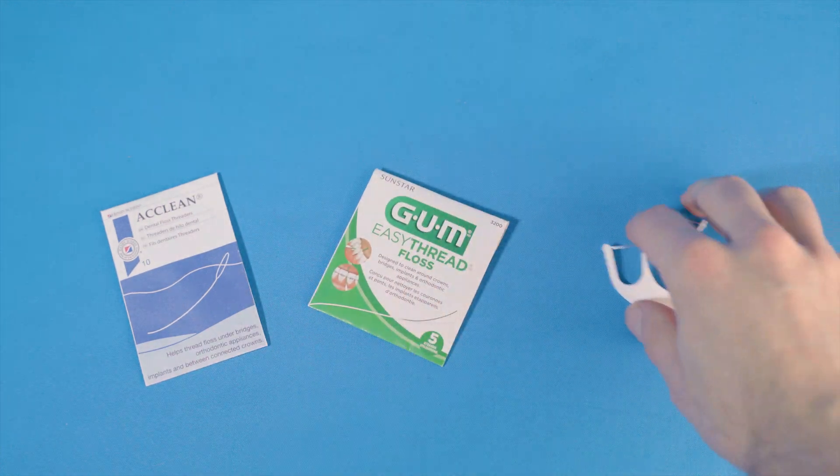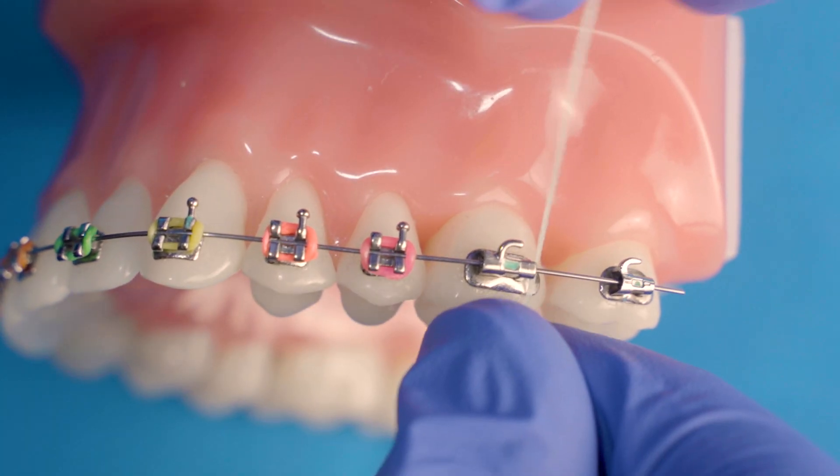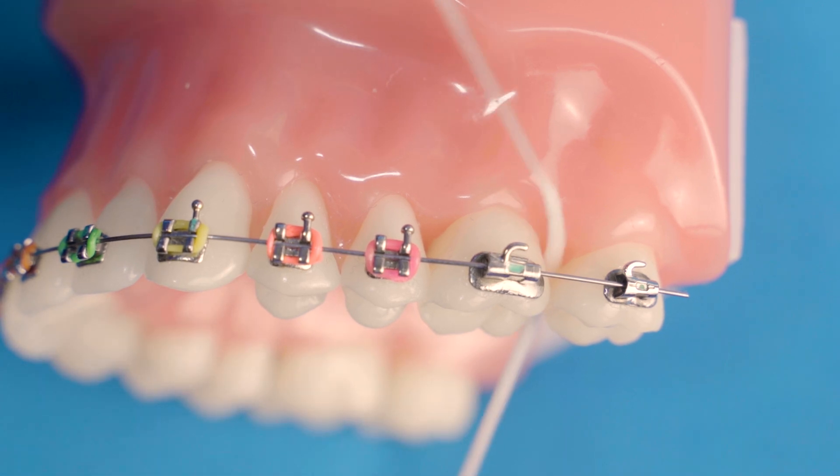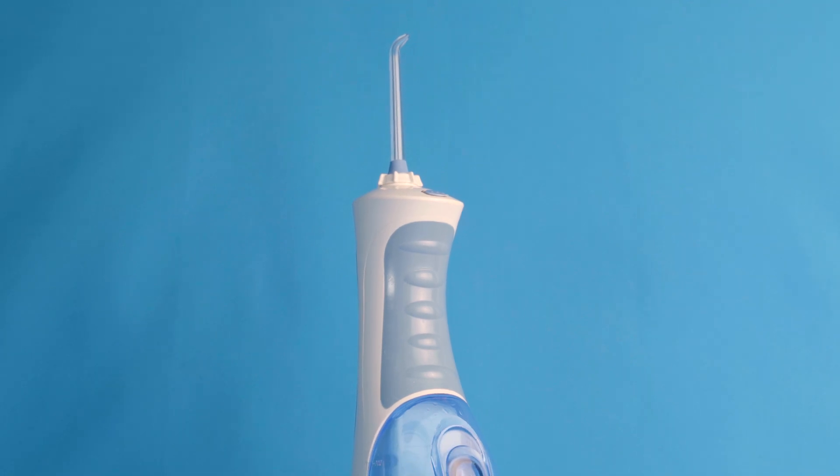Flossing is also very important. You'll need floss threaders, super floss, or orthodontic flossers to help get under the wires. With the threaders and super floss, feed the stiff end underneath the wiring. Then thread the floss between the teeth and move the floss along the V shape of the gum. You'll need to do this for each individual tooth. It takes time and practice, so set some time aside every day — you may also need help from a parent. Water picks, water flossers, and proxy brushes are also great; however, they do not replace regular flossing. Please take your time with these tools and don't rush.